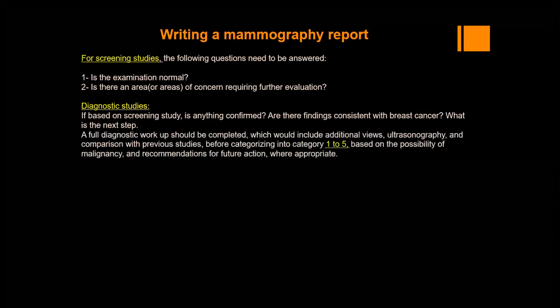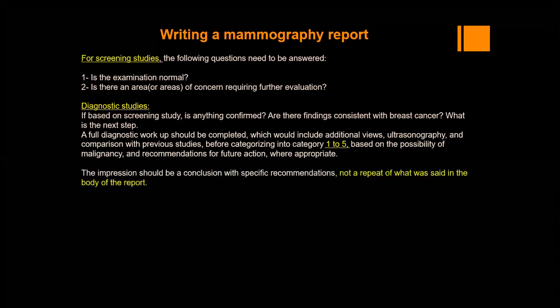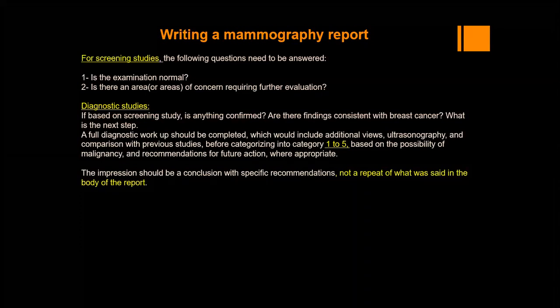A full diagnostic workup should be completed, which includes additional views, ultrasound, all of these, before categorizing from 1 to 5 based on the possibility of malignancy, and then recommendation for future actions where appropriate. And the impression should be a conclusion with a specific recommendation, not a repeat of what was said in the body of the report.